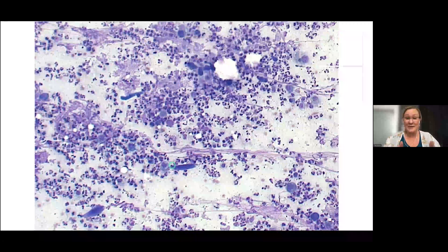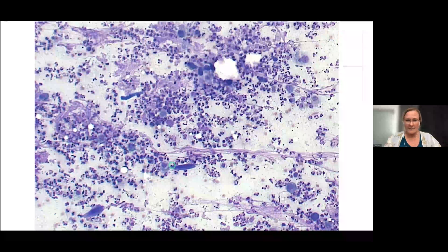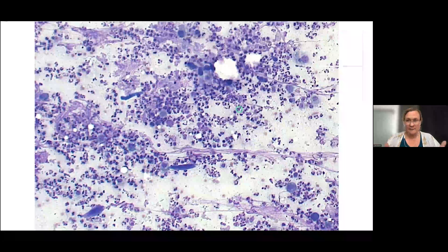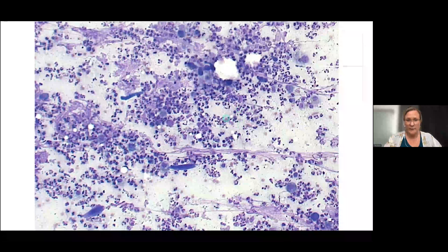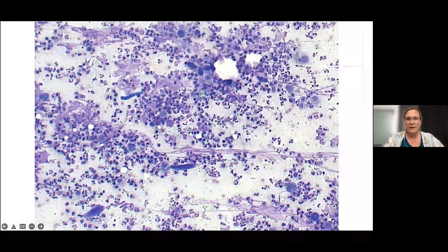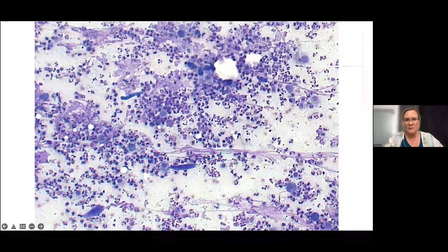These are cytology photos from a representative lung aspirate. At this lower objective view it's a little tough to see all the cells, but the first thing to notice is that it's super cellular. Lung aspirates are typically not very cellular because the lungs are filled with air, so already we're noticing abnormalities. There are a lot of inflammatory cells — big groups of neutrophils with some macrophages. You'll also notice streaming material throughout several of these photos, which are lysed cells that have ruptured, leaving only nuclear debris.